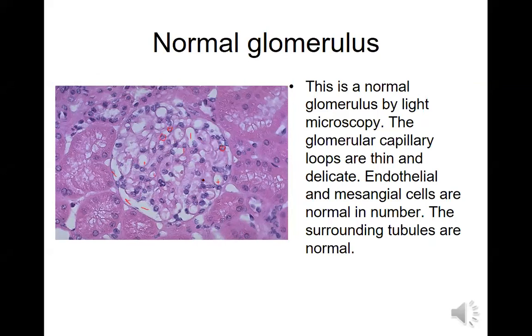You don't have to name those. This is just, all you have to call this is a glomerulus and know where the space is. And know what a glomerulus is.